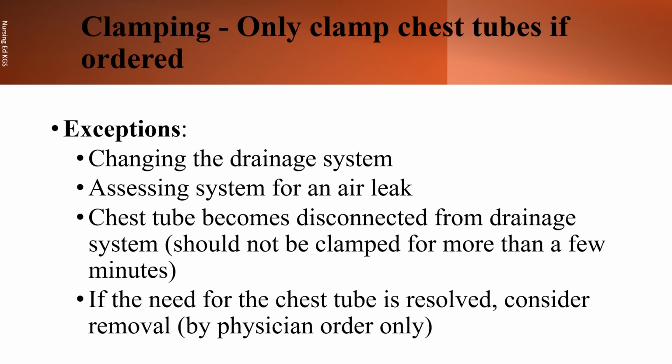As a standard, we never clamp chest tubes. Reclamping a chest tube may lead to the redevelopment of pneumothorax or development of a tension pneumothorax. Chest tubes are only clamped if there's a doctor's order to clamp or a valid reason. The tube must remain unobscured and unclamped to either drain the air or the fluid from the pleural space. There are, however, a few exceptions where clamping a chest tube is okay.